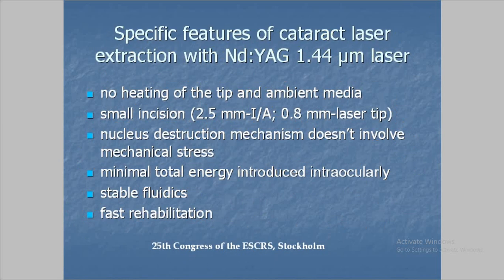I would like to remind the audience of the specific features of cataract laser extraction with neodymium YAG laser, 1.44 micrometers wavelength, which is a Russian focal laser system. It is characterized by no heating of the tip and ambient media, and a small incision, which is 2.5 millimeters for I/A and 0.8 millimeters for the laser tip.